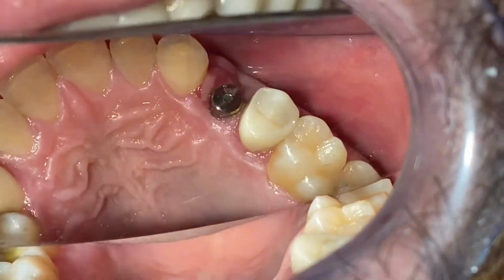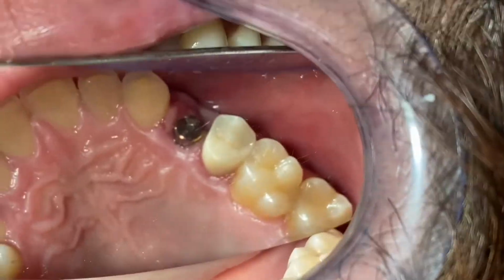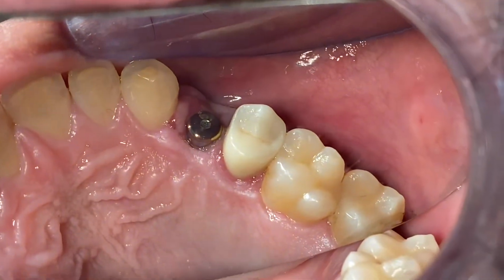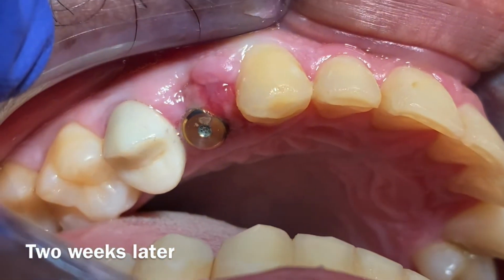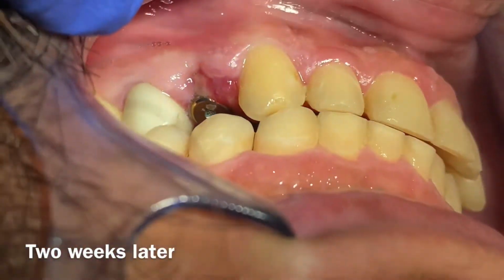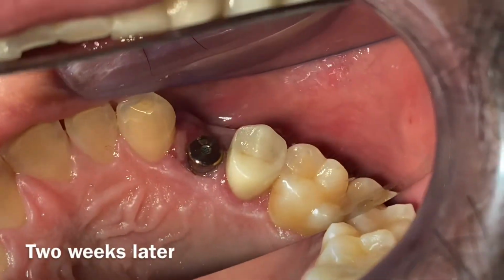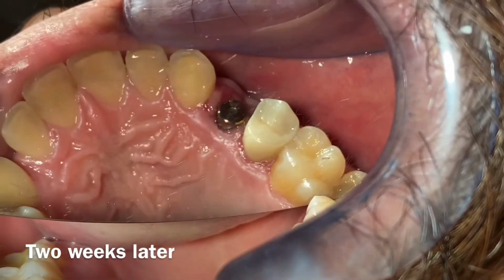Now this is the post-op at 2 weeks, the temporary came out. So you noted that the soft tissue has already regenerated around the implant area, including the buccal surface. So that's the good side. I told the patient this is the good side. We're gonna try to not have anything right there at this moment, because the particulate bone is covered with the soft tissue by now.